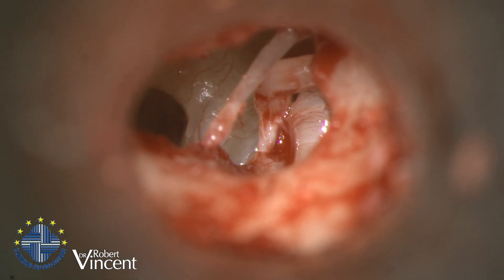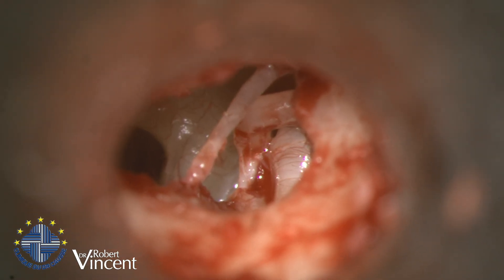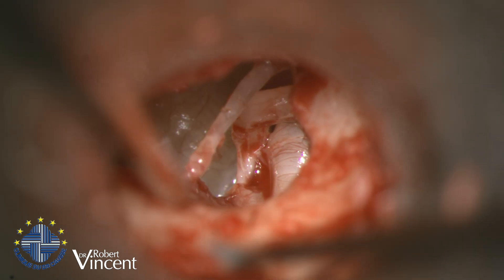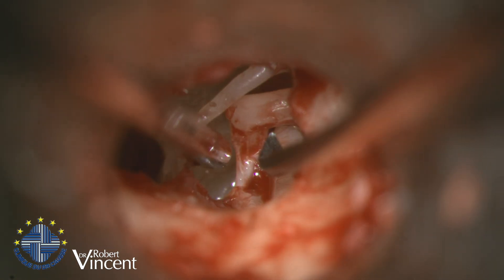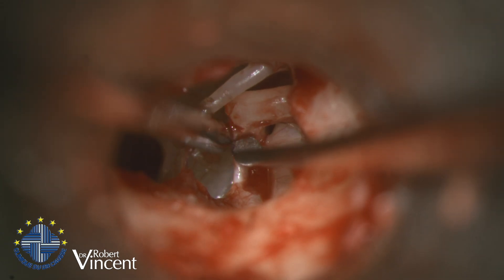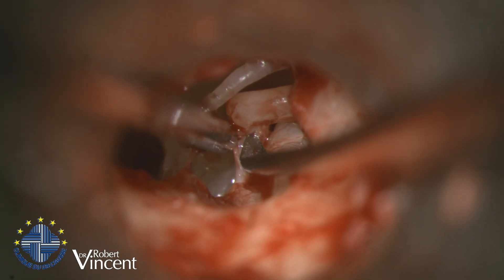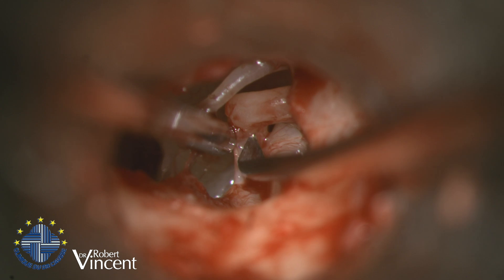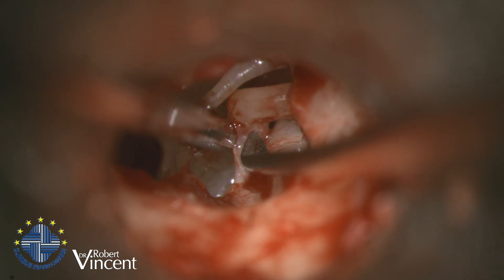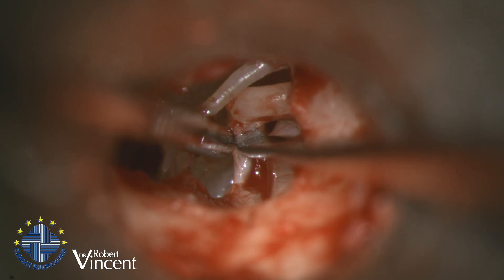The problem will be to remove the stapes superstructure. The first step is to remove the superstructure. I'm going to separate the incus from the stapes as usual. To check the ossicular chain mobility, we need to rule out malleus and incus problems, and check the stapes fixation to ensure it is completely fixed.